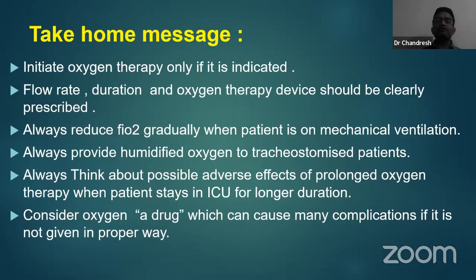If your patient is on ventilator support, and you find that the patient is having copious secretions or maybe crusty secretions, it is always advisable to start the humidifier as soon as possible, along with the invasive ventilation, along with the circuits. If a patient is tracheostomized, maybe they will be breathing through room air also, sometimes on thermovent. But always remember, a tracheostomized patient will always require some or other modality of humidification. So the HME filter, which is made of corrugated paper and can maintain the humidification, should be there on the tracheostomy tube.